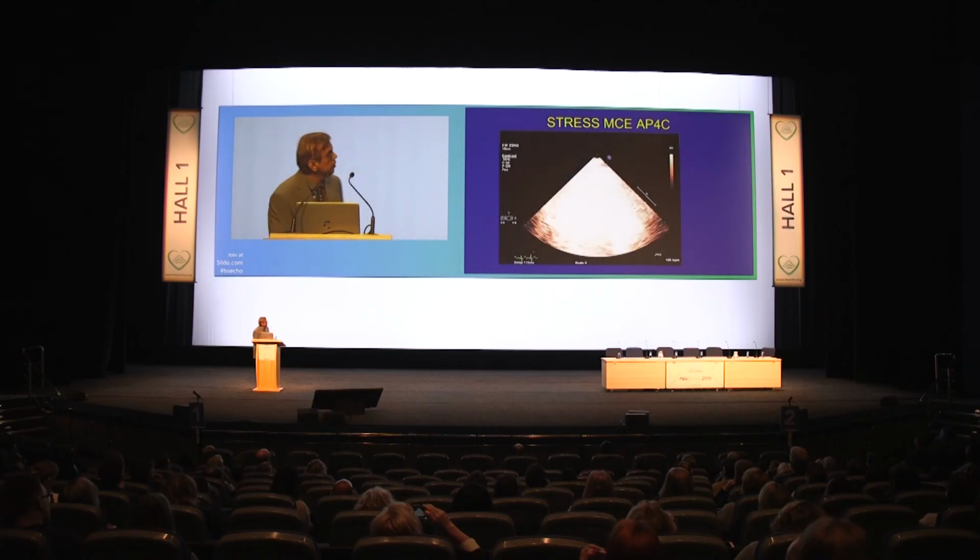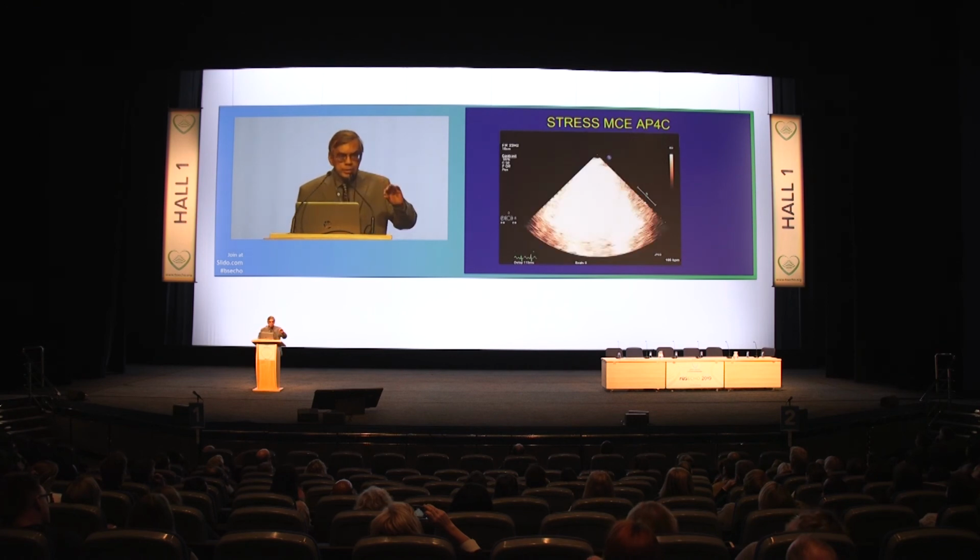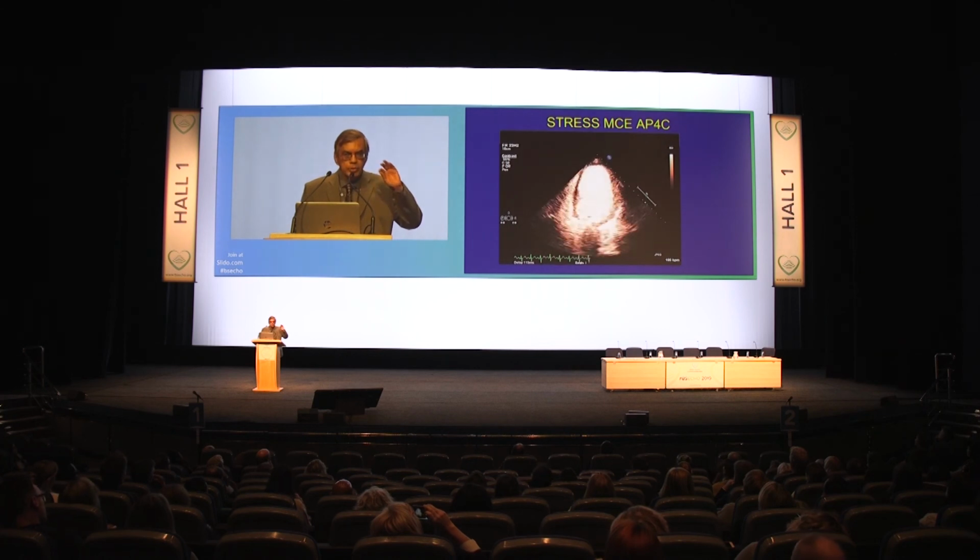Now, this patient then underwent stress echo, as you saw, and we did peak imaging. If you look at it now, this is peak stress, and now look at the perfusion defect there. So at rest, there was capillary perfusion. During stress, it's down. So that's ischemia. And it's not blooming because it's different between rest and stress.